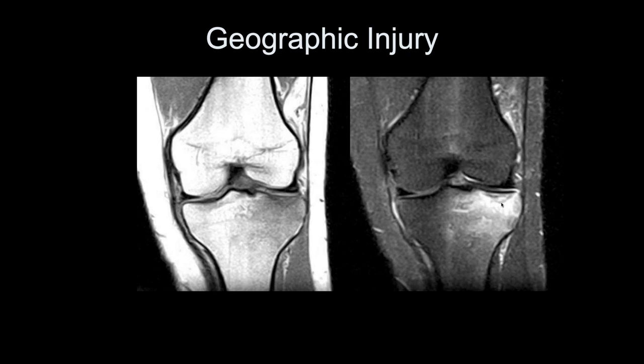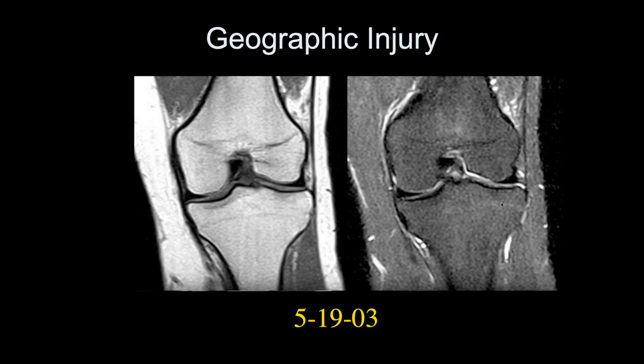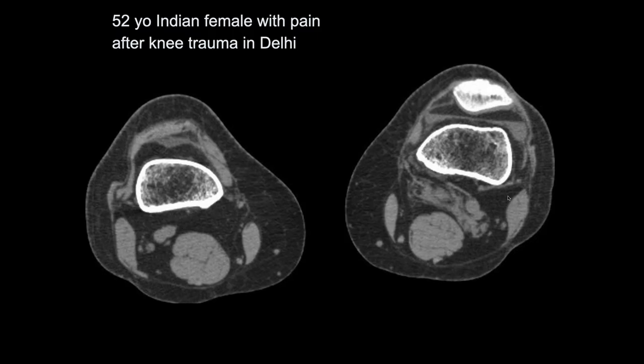Yeah, it's hard to say. All we know is that the amount of force on the bone was more than the bone could take, so whether it's due primarily to weakened bone or to increased pressures, it's hard to say just looking at the MRs. Okay. And this is what it looked like a year earlier.